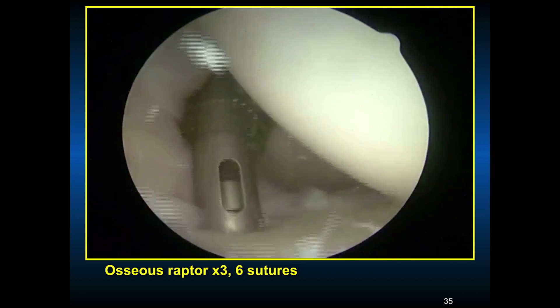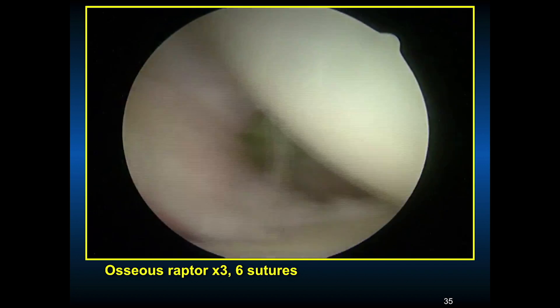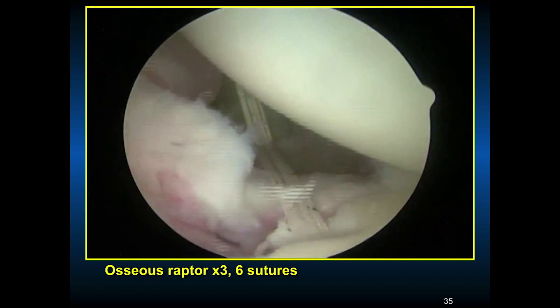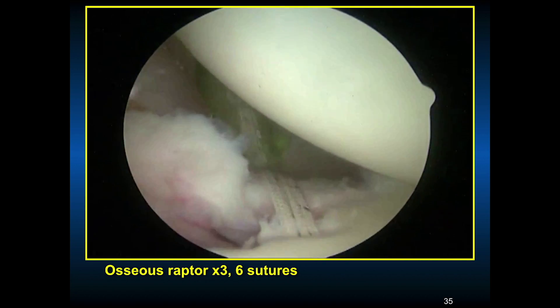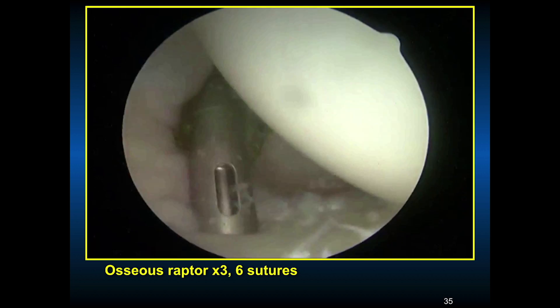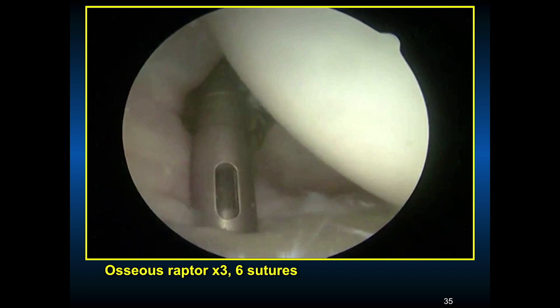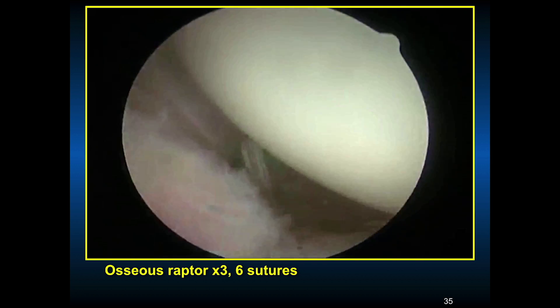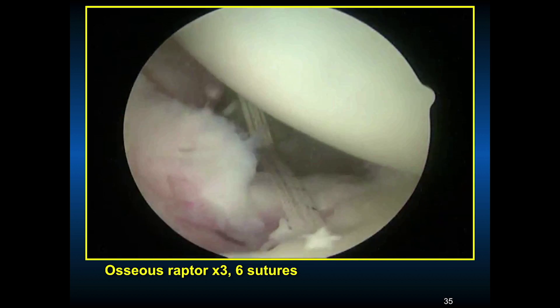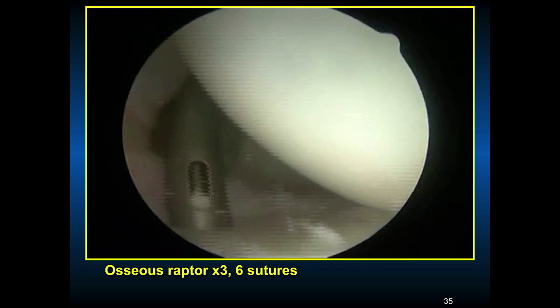The glenoid has been prepared and the anchor is going in. You have to get as perpendicular as you can, and high on the face of the glenoid, to be able to advance the tissue as much as you need to restore stability. Know whether you need to drill and tap it, and know your system that you're using — there are many different labral repair systems. It is certainly nice to put the suture in the bone and then pass the suture.